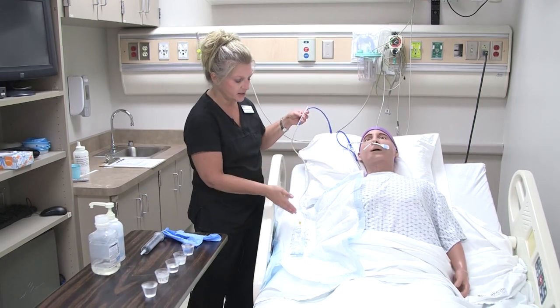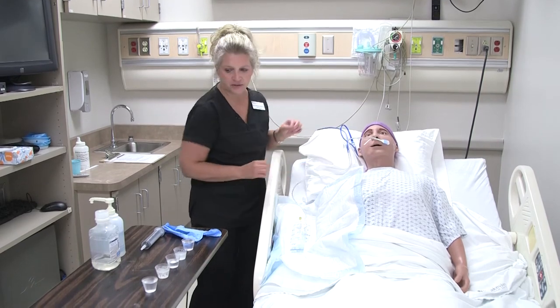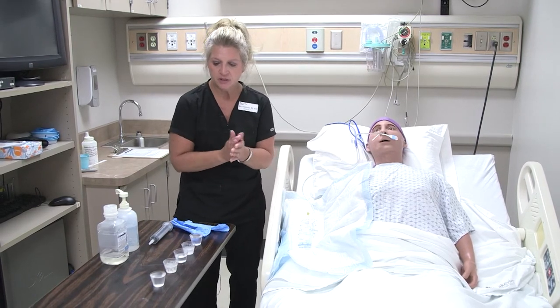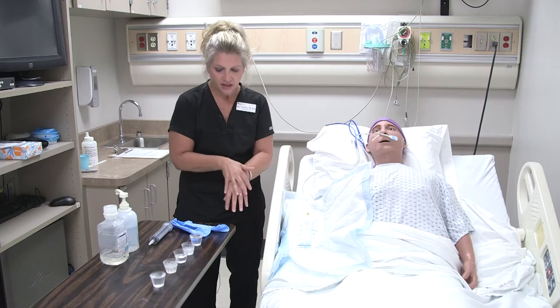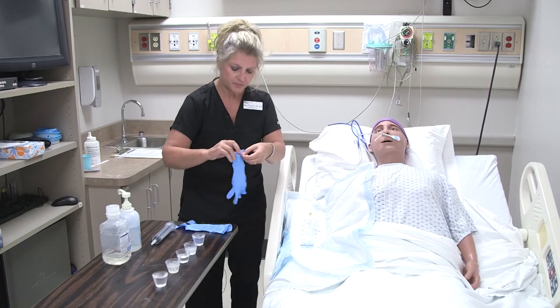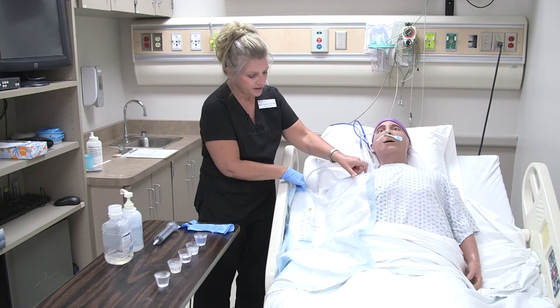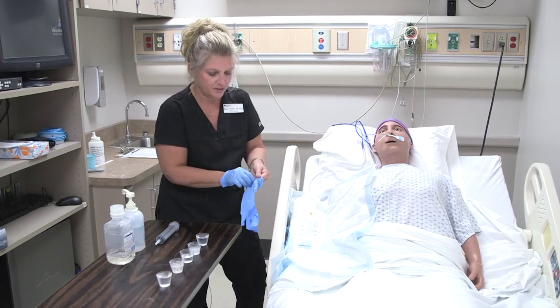I'm using this as a simulation since the mannequin cannot tolerate enteral feedings or medications going into it. I'm just going to do hand hygiene. This will also be performed by gravity. We do have a pad underneath the area so that in case we have any spillage, it doesn't get on the patient or the bed.